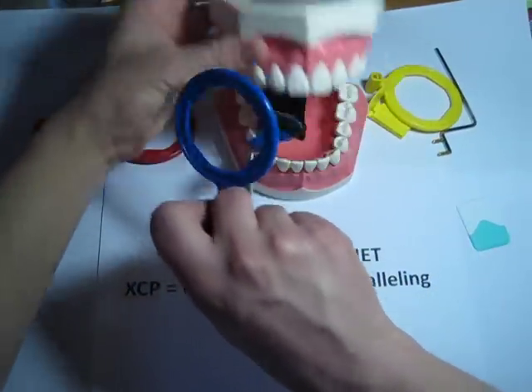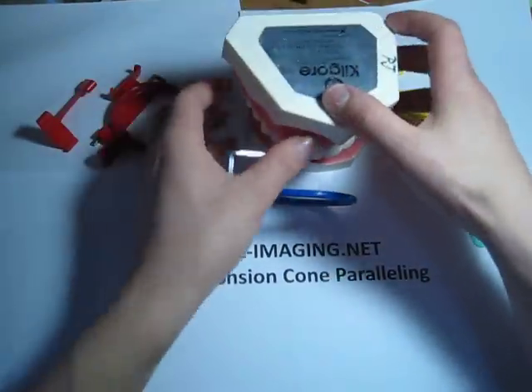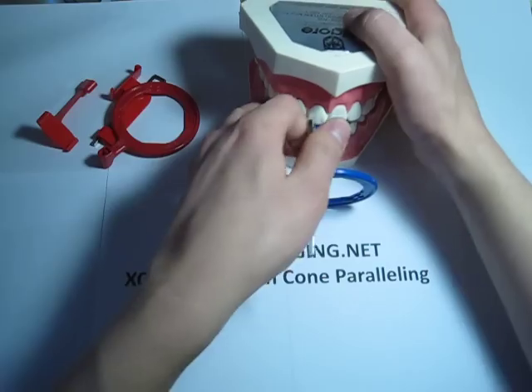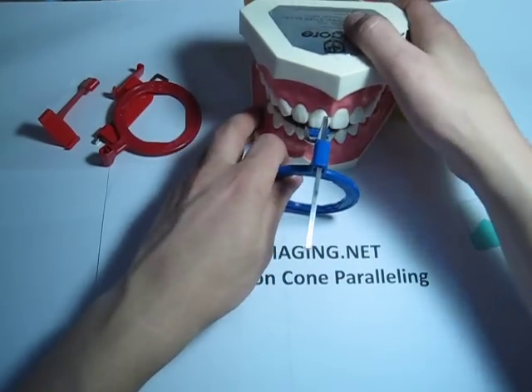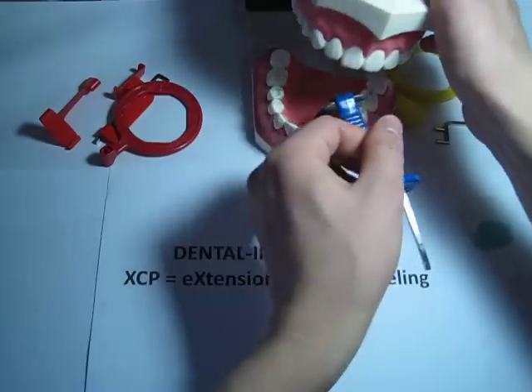Same thing for this one. And then for the lower teeth, you would just flip this facing the lower teeth — do the middle, do the canine, and the other canine.